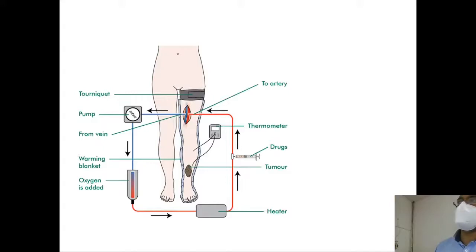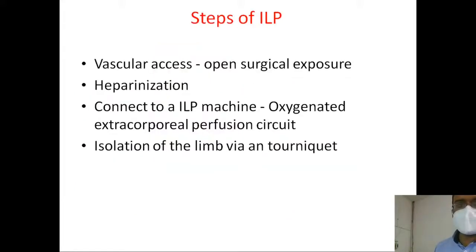So here we can see that this is the temperature monitor. We have to measure the temperature with the temperature probes in the whole limb throughout the procedure. Now coming to the surgical steps of ILP.